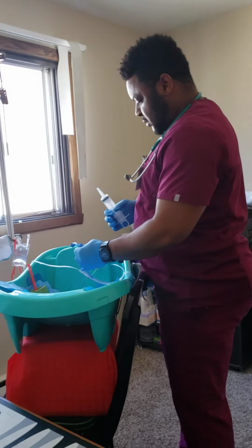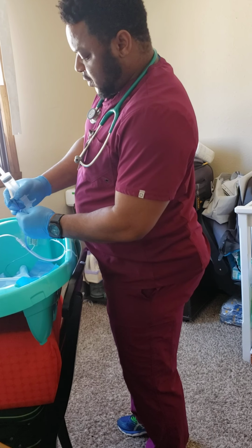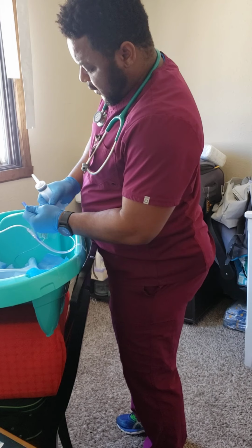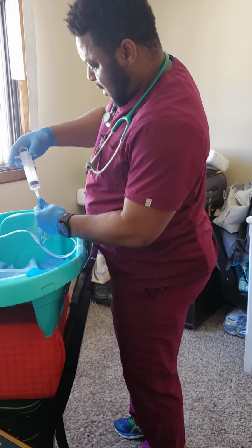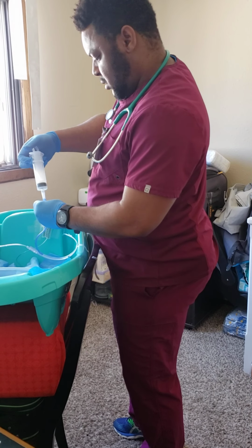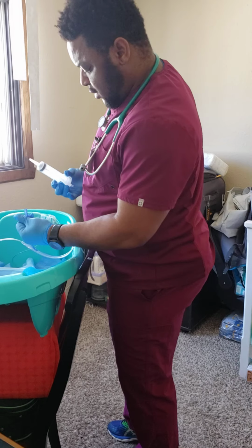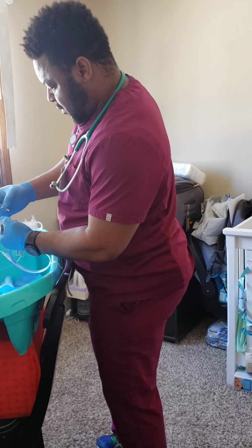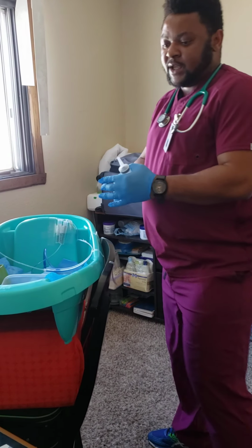I will then take this blue section of the tube. I will want to take this off. Take this off by clamping it at the bottom. Put it, allow it there. Send in my air. Clamp it back. Take this off. Take my tube in here. Clamp it back. So that is it.